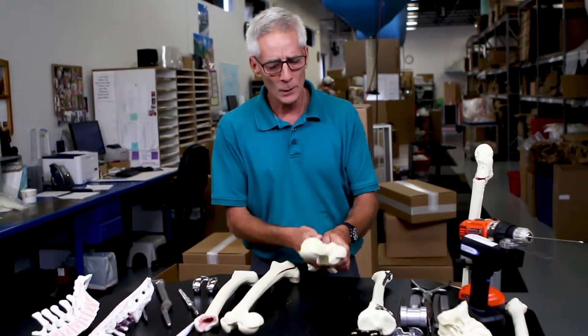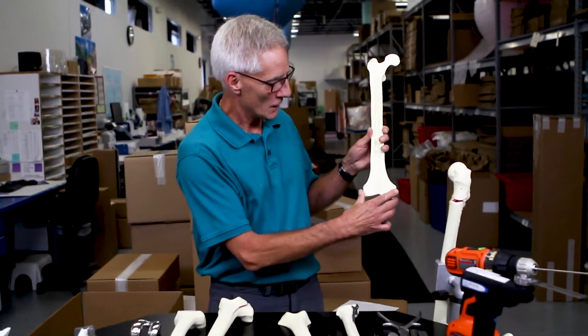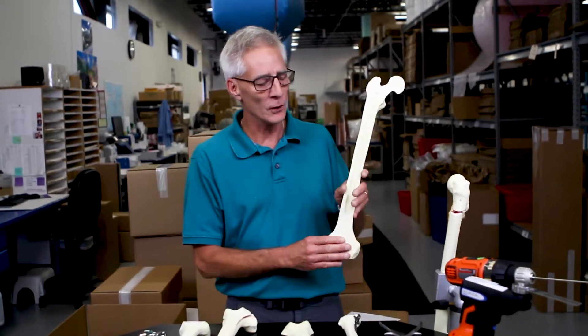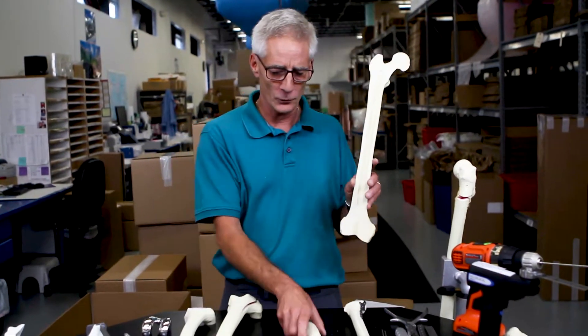In the beginning, we created what's called solid foam. You can see here it has the same type of material density throughout. And this was very useful at the time and still is for doing basic osteotomies, external fixation, and some plates and screws.